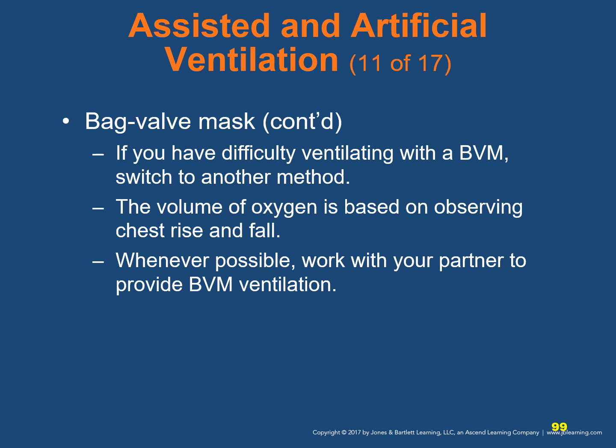with reduced tidal volume, explain the procedure to the patient if the patient is coherent. Initially assess respirations at the rate the patient has been breathing, squeezing the bag each time the patient inhales. For the next 5 to 10 breaths, slowly adjust the rate and delivered tidal volume until an adequate minute volume is achieved.